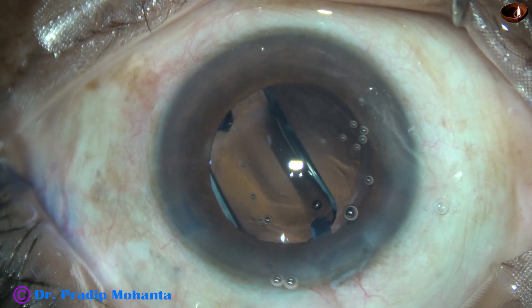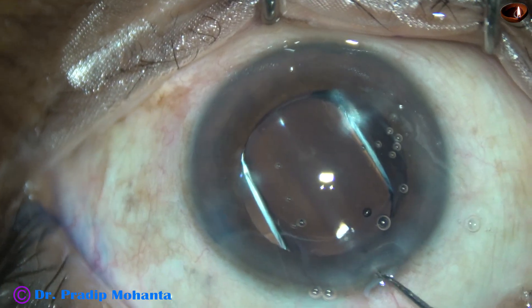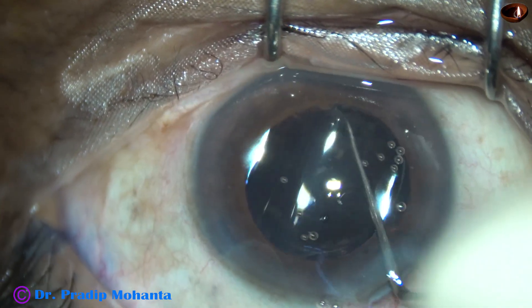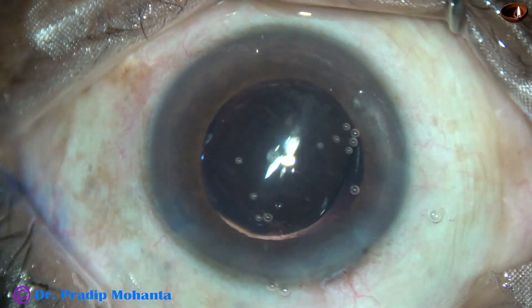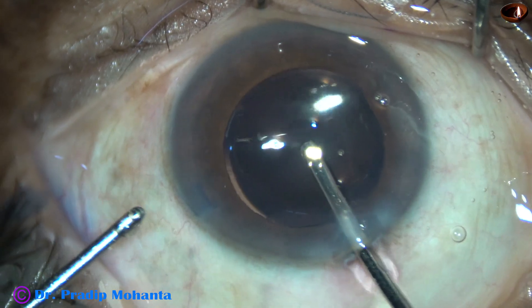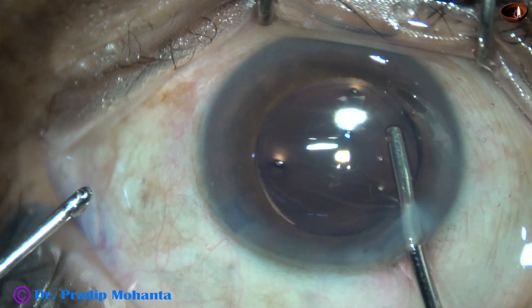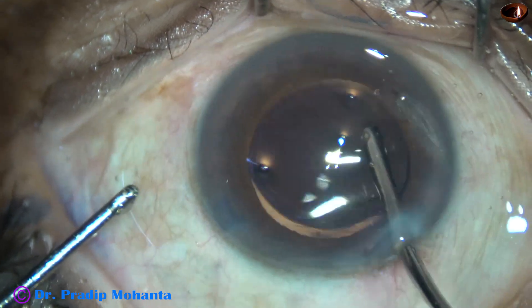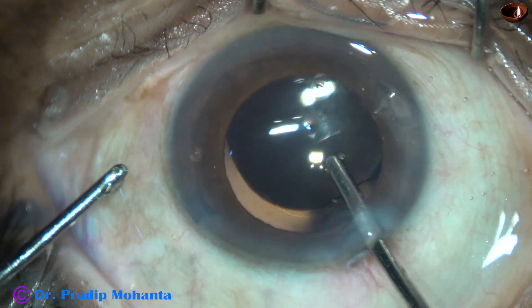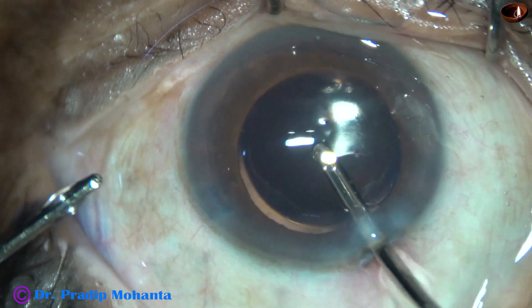Now the intraocular lens has to be checked whether it is in the capsular bag or not. How to do that? If we can hook the rhexis margin opposite the haptics, the lens is in the capsular bag. Now the Visco is nicely cleaned. This is the irrigating probe of bimanual I/A. Irrigation of the anterior chamber is done, then the capsular bag is irrigated so that the Visco comes out through the main wound. Irrigation and aspiration are used together.